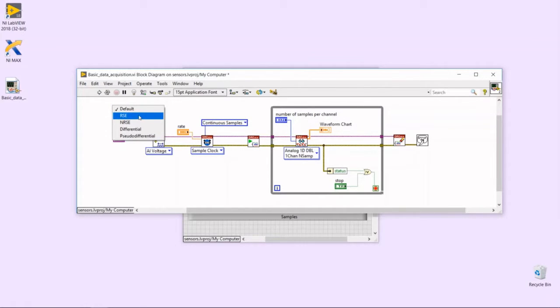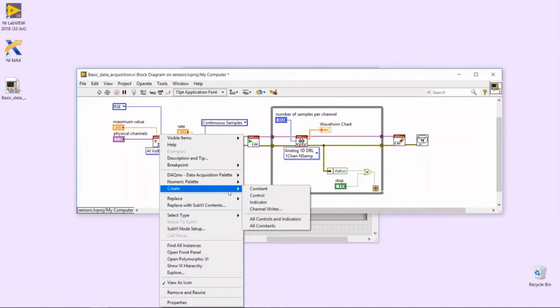And there are RSE options and differential options. So RSE means referenced single-ended, and it measures a signal that comes to the analog input relative to the ground. Differential means that we are measuring the difference between two signals that are connected to the plus and minus sign of our analog input. Because we want to measure relative to the ground, we are going to select RSE. For maximum value, we are also going to set a control, so we can change that on our front panel. And for minimum value, we are going to set a control also.